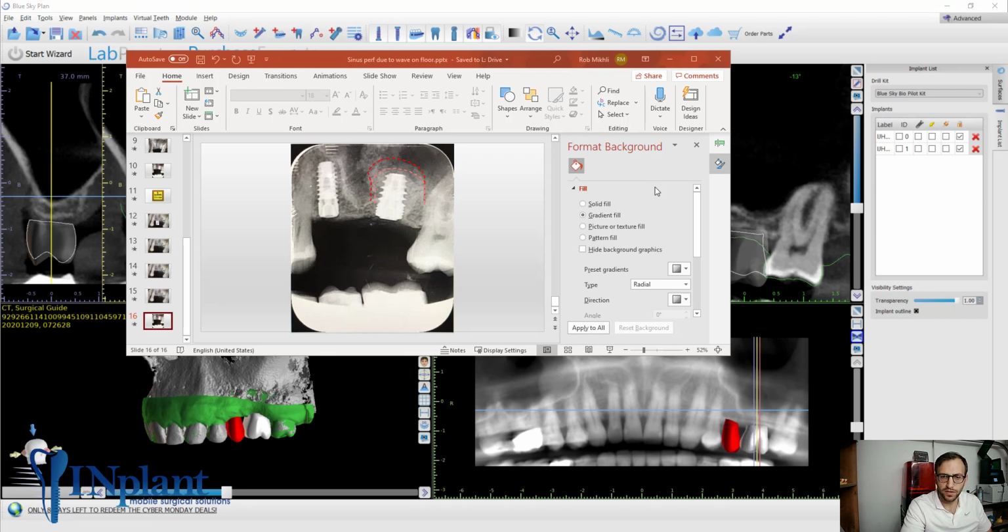So again, this was a situation where, even though it worked, we had a complication in the middle. We handled the complication. The case got completed successfully, and we learned something along the way. And really, those are my favorite cases. I was told by my great mentor, Dr. Sheldon Lerner, the day you do your perfect surgery is the day you retire. Meaning, if you're not learning from every case, it's time to hang it up, because there's always something to learn from every case. I learned a lot more teaching than I do even when I'm practicing my own, because I can look at it with a much closer eye than I have time for in my day-to-day private practice.